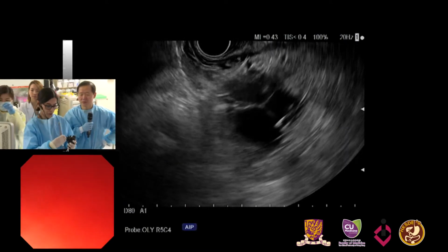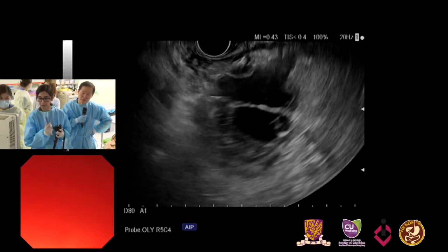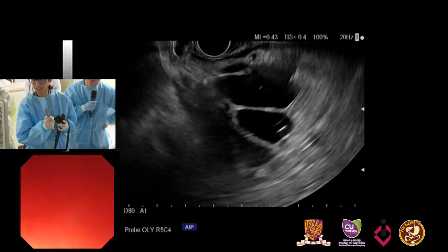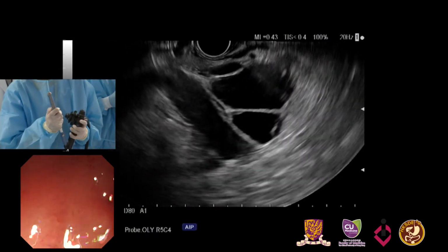So our confocal probe got a little stuck coming out, so we did pull our needle out. I try not to re-stick these lesions as much as possible, and then I do try to aspirate all the fluid out. We did give the patient pre-procedure ciprofloxacin. I don't tend to give antibiotics after if I can aspirate the entire lesion.